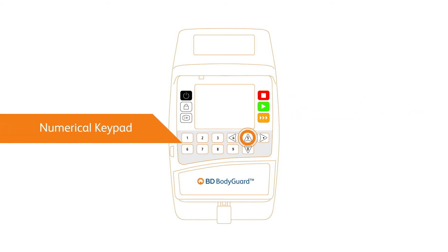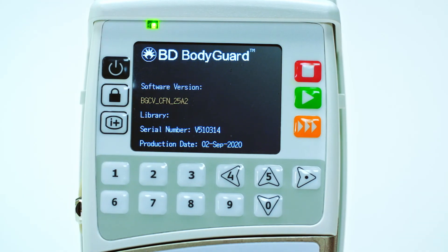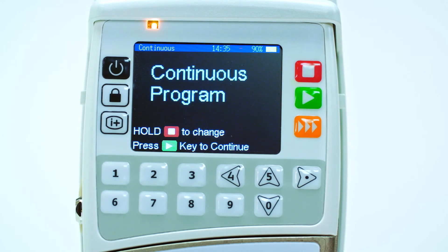Keys 5 and 0 allow for scrolling up and down through device options, in addition to inputting values for infusion setup. To turn the pump on and off, long press the top left key surrounding the screen display. The device name and software will illuminate on screen. Several of the device keys have multiple functions, depending on the program settings and treatment requirements.